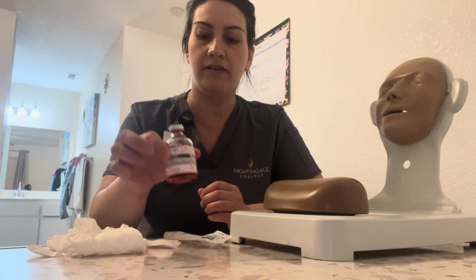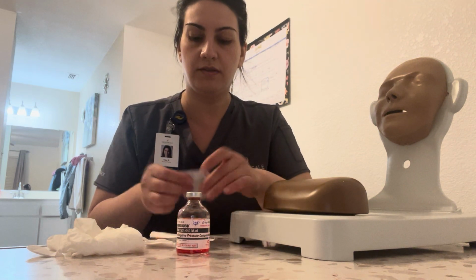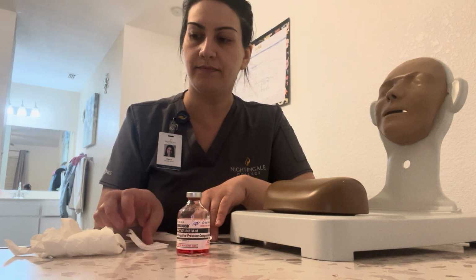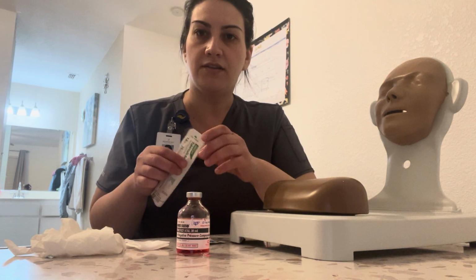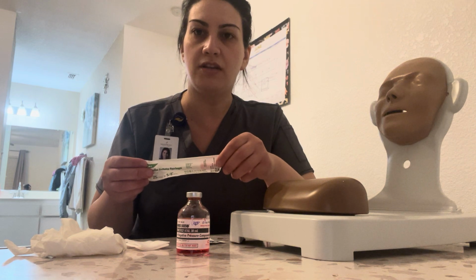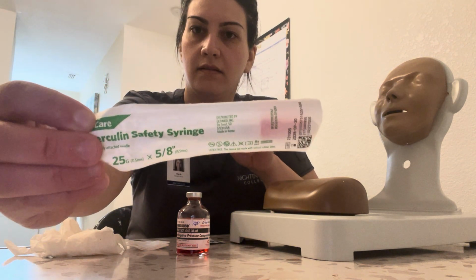I'm going to be performing the skills video of subcutaneous injection. For the skill video, we need our medication vial, syringe and needle, 2 alcohol wipes, pair of gloves, and gauze pad. For this injection, we're going to need a 29 to 30 gauge half-inch needle, 1 milliliter syringe. Due to supplies, I'm going to be using this one.